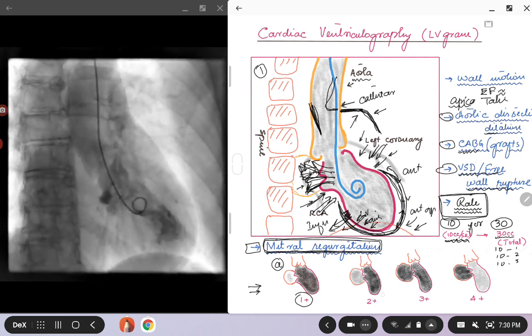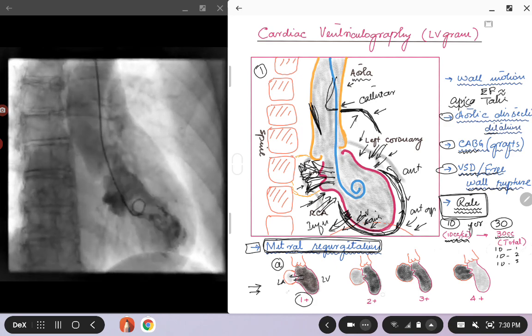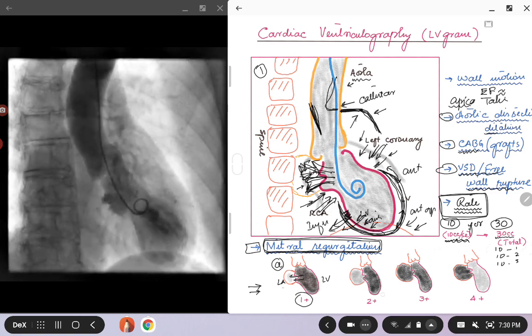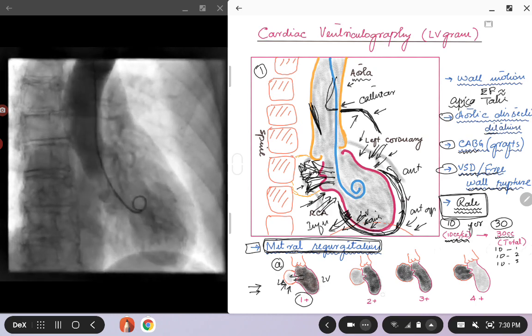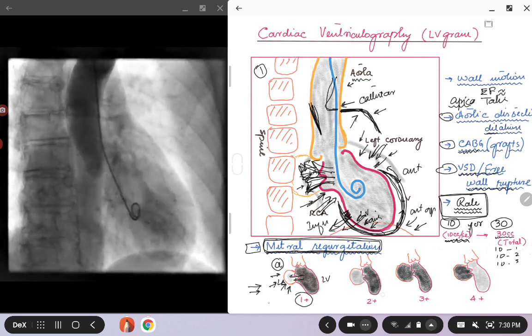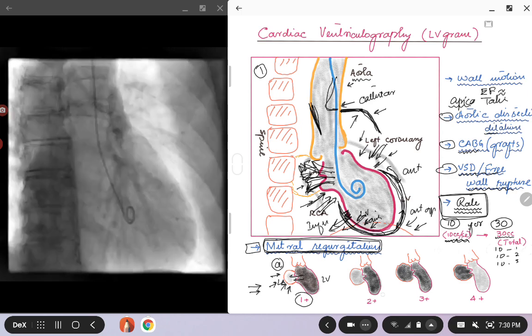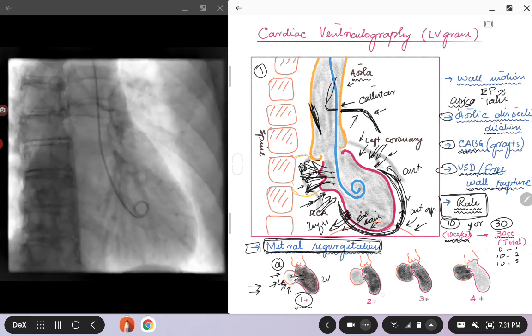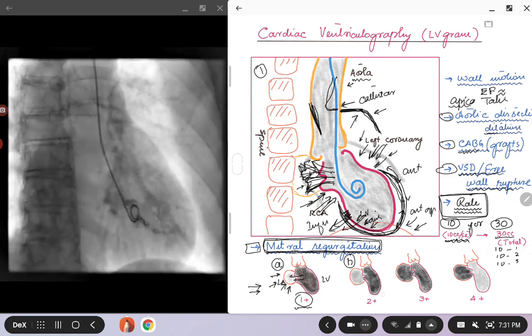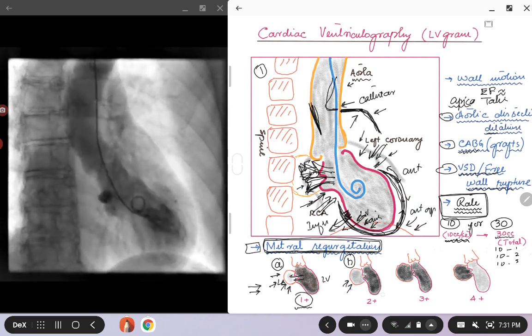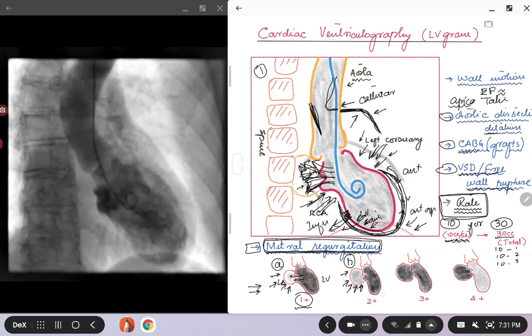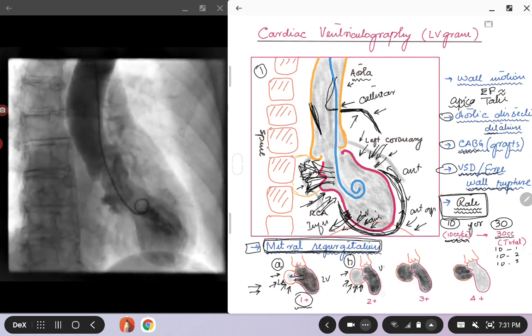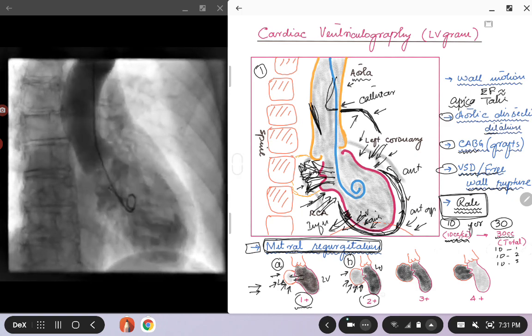Looking at picture A: if you see dye going into the left atrium but only a very small amount — such that the left atrium is never darker than the left ventricle, the left atrium is not dilated, and within one or two beats the dye in the left atrium clears — that is probably mild mitral regurgitation, or 1+ MR. Moving to picture B: you see more dye into the left atrium and a little bit of dilatation of the left atrium, but again the left atrium will never be darker than the left ventricle. In this case you can call this 2+ mitral regurgitation.